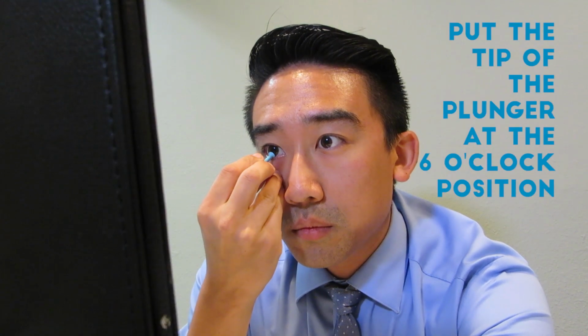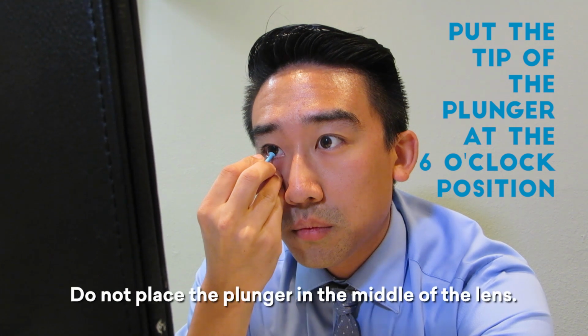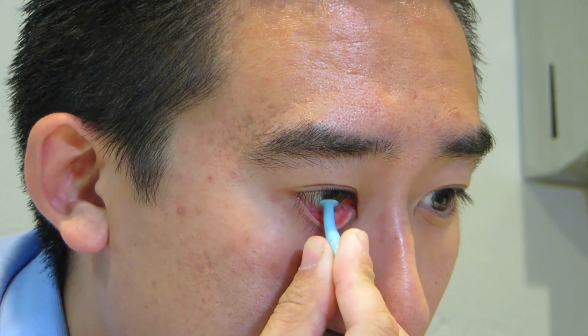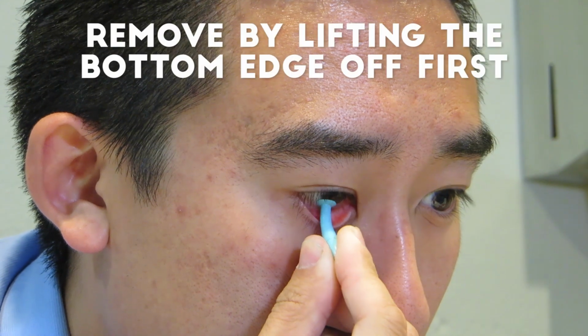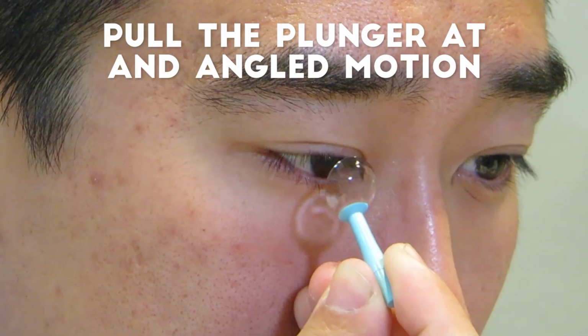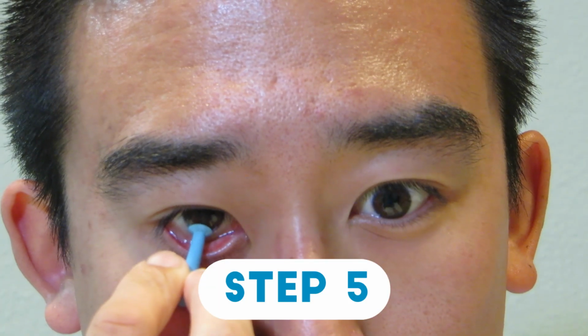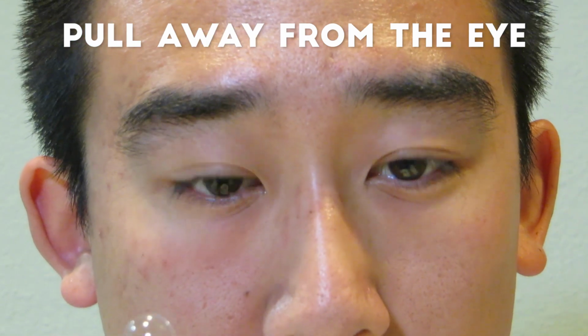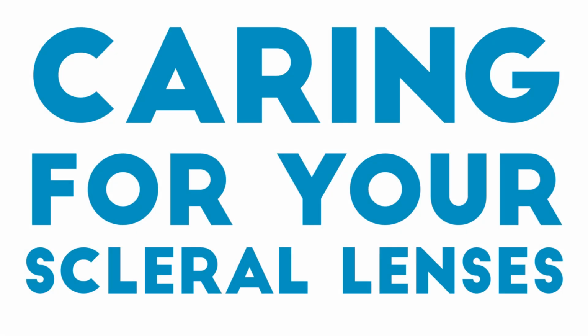Step 3. Using the removal DMV plunger, put the tip of the plunger at the 6 o'clock position. Do not place the plunger in the middle of the lens. Step 4. Gently remove the scleral lens by lifting the bottom edge of the lens off first. Pull the plunger in an angled motion. Step 5. When removing the lens, pull away from the eye so that the contact does not scratch your eye.